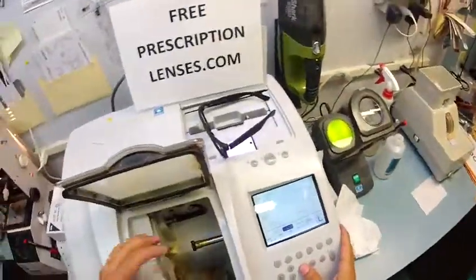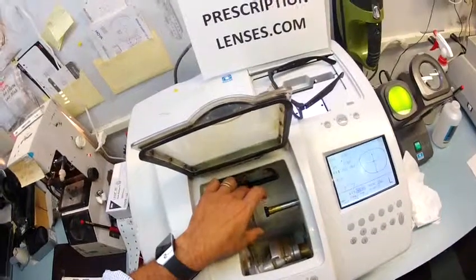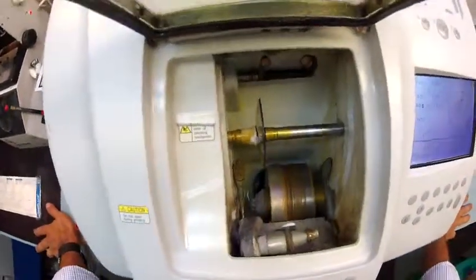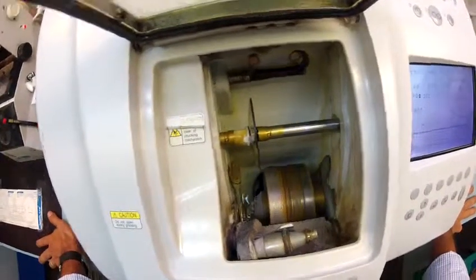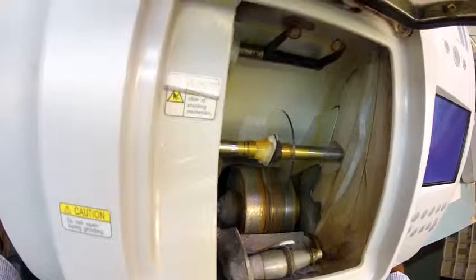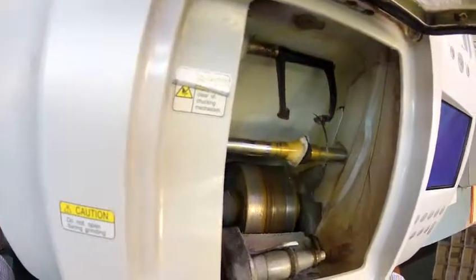So now I'm going to do the same thing for your left lens. Just like before, the calipers are going to come down, but this time they're going to trace the shape of your left lens. If you use your imagination you can see the shape of your lens being traced on there.